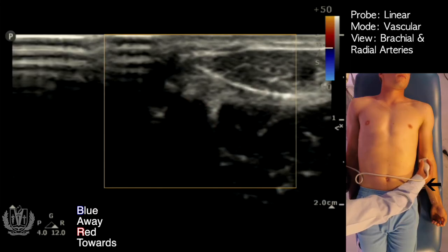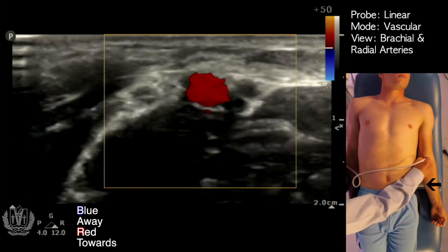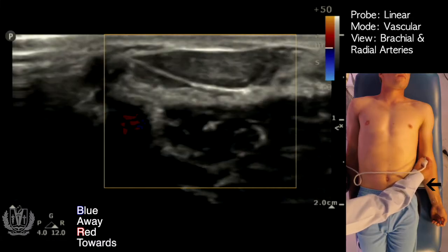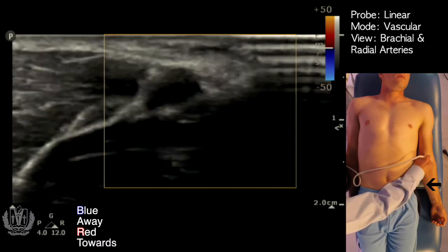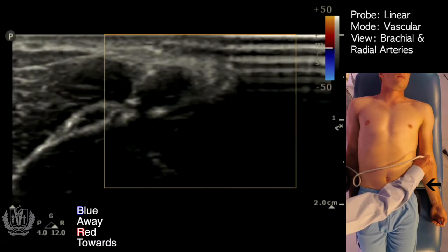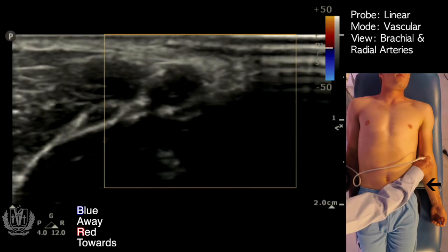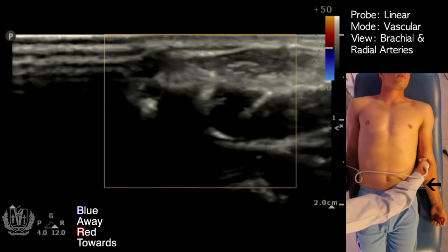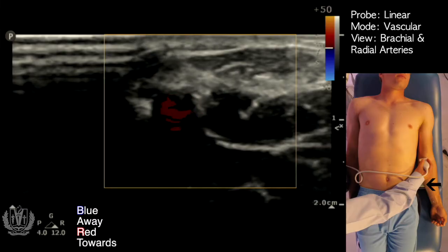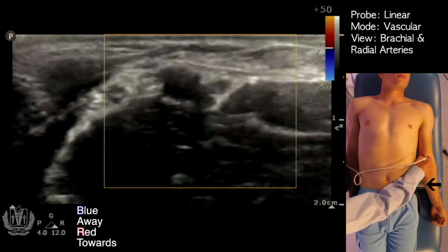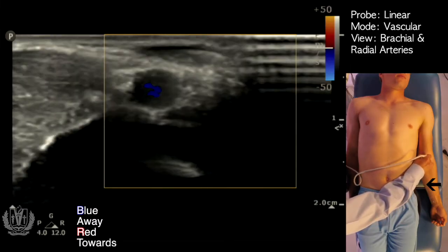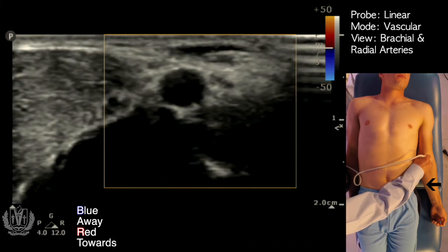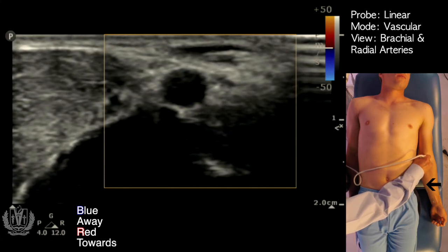Once again, red is towards the probe and blue is away. You can see it's red here. Now I'm shifting my probe, so the flow is going away from the probe and it turns blue. And that is the brachial artery.